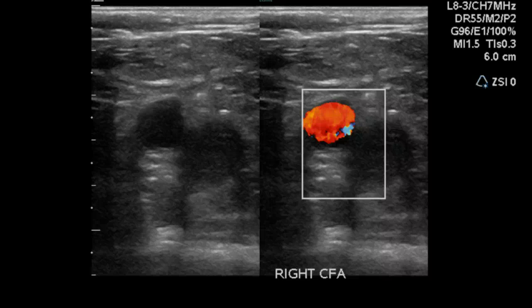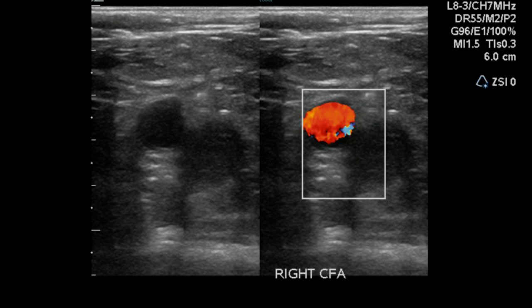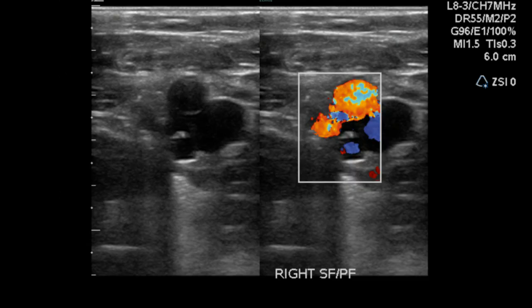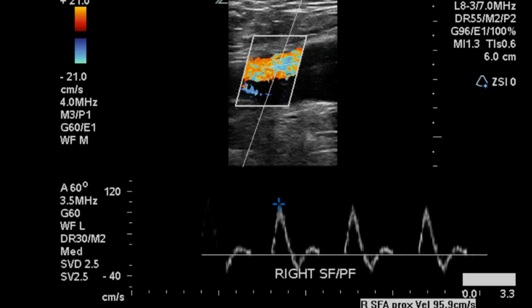Let's go over some key points we look for when examining the lower extremity arteries. First, the sonographer begins at the right common femoral. You can see here on the left there is an image of the common femoral in transverse, and on the right color doppler is employed. Spectral doppler of the right common femoral shows a normal triphasic waveform. Moving segmentally down the leg, we see that the triphasic waveforms continue.